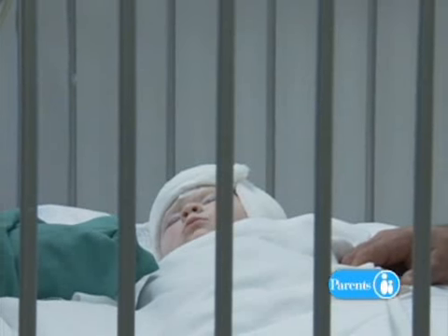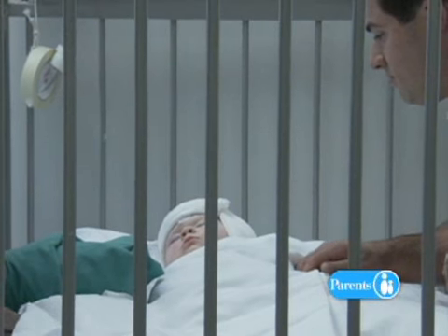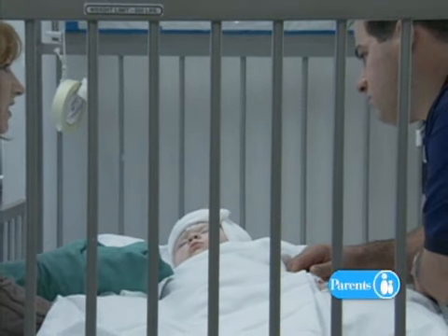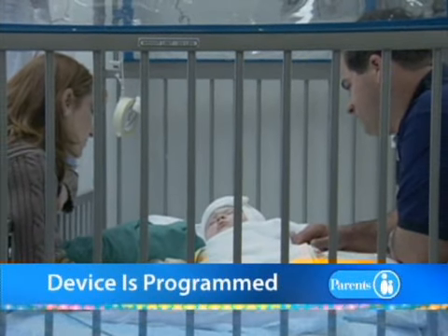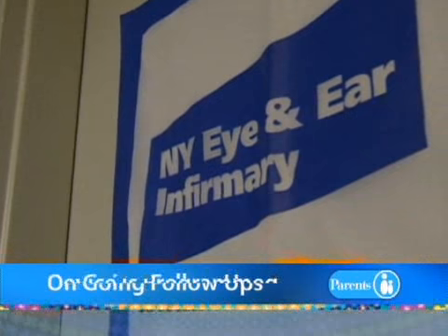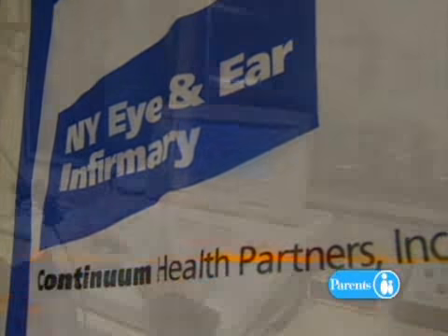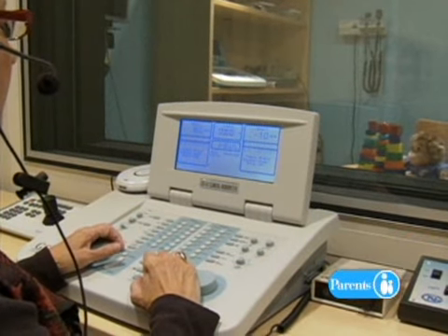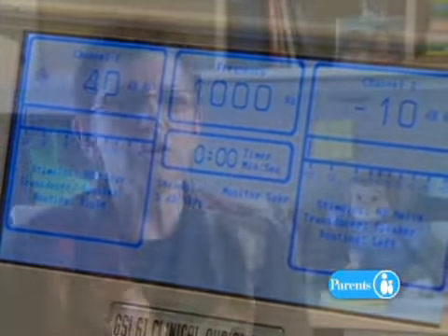Once it heals, the family returns to the Hearing and Learning Center, where we can teach them how to use the speech processor, what they need to do to take care of it, and we can program the speech processor so that it works for the particular child. In the beginning, we see them every couple of weeks because as their brain is getting exposed to sound for the first time, their ability to listen changes by the minute. And so we keep seeing kids every couple of weeks on an ongoing basis until they sort of simmer down and we've gotten them so that they're hearing in a pretty steady state.